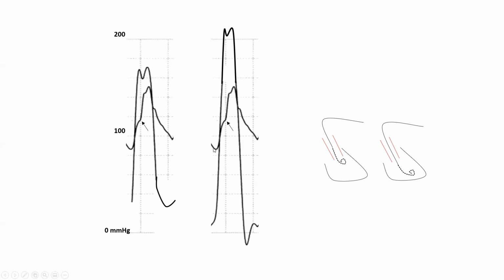Some of those side holes will be contaminated by the aortic pressure. So some of the LV will be contaminated by aortic pressure. So it will be mixed LV aortic pressure, which attenuates that gradient, okay? Because you're contaminated by the aorta. You're halfway in the aorta, so you get a halfway gradient in a way. So you should ensure your catheter is deep when you're doing recordings, okay? And that's one of the errors you should seek whenever there is some discrepancy between morphology and severity.